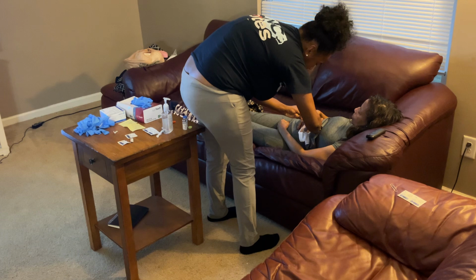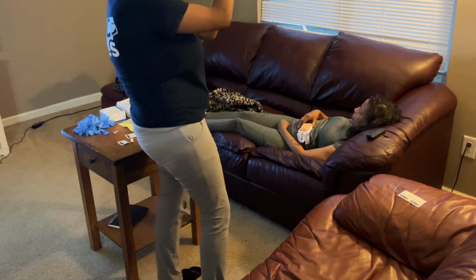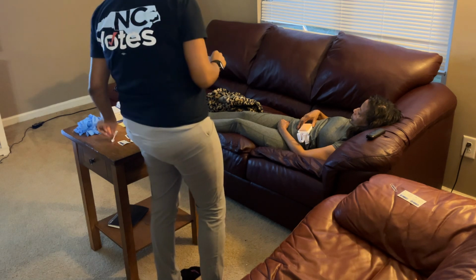I insert all the way down. All right, I remove the needle. I engage the safety. This would be in my sharps container. I will put this in my sharps container.